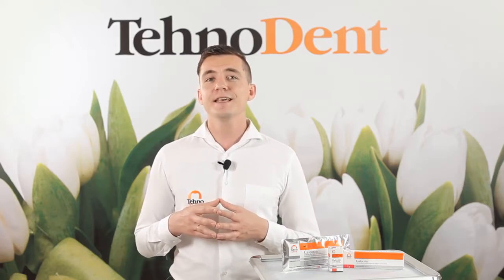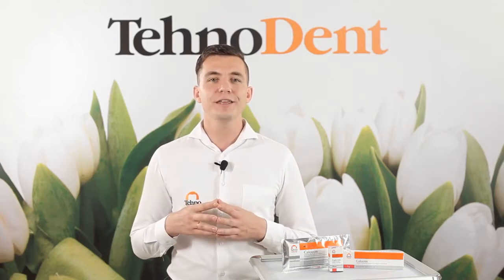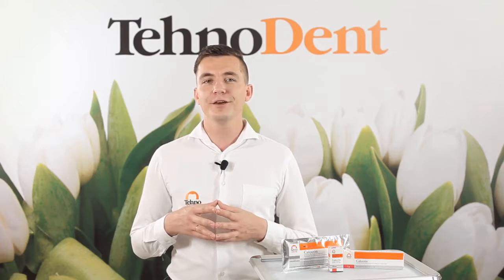determines the periodontal condition. It is necessary to put a fresh portion of paste in the root canal one time every 3 months to complete the formation of the apical barrier. When the apical barrier is formed, the final filling of the root canal with the sealer should be applied.